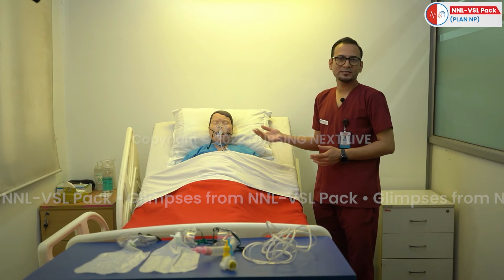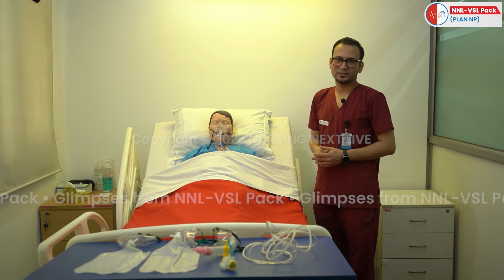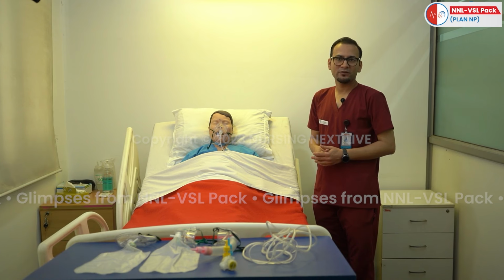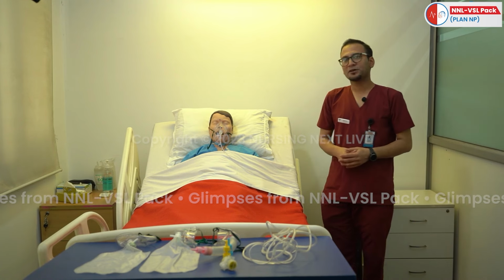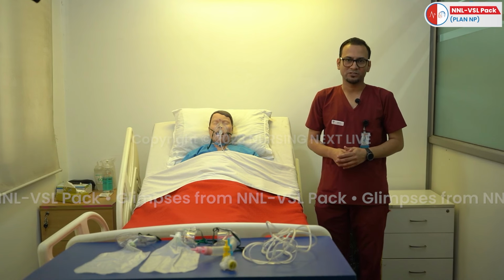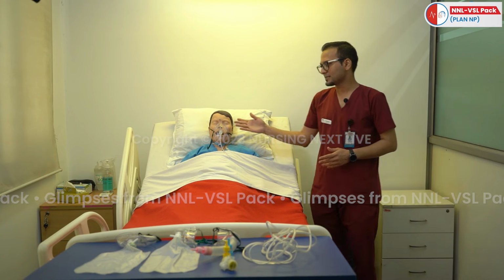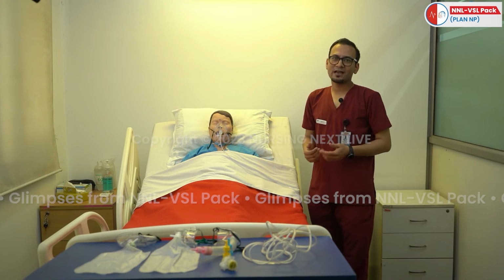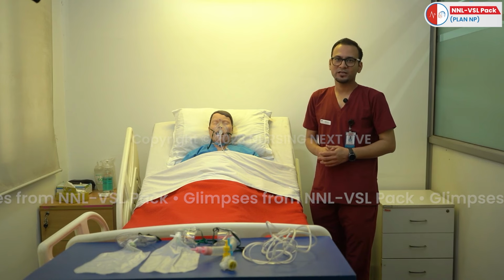And with the help of this simple face mask, we can deliver 4 to 8 liters of oxygenation. That means we can deliver 45 to 60% oxygenation. And this mask is widely indicated for the patient who is having chest pain, dizziness and minor hemorrhages, and it is contraindicated for those patients who are not able to keep the mask in place, patients who have a psychological effect of mask therapy, and patients who have a facial injury.